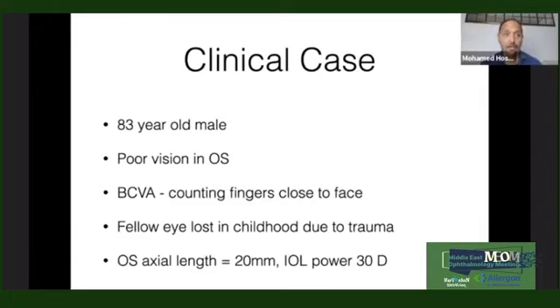If you definitely know that this patient has a weak endothelium, if he had recurrent corneal edema episodes and you had to treat it with hypertonic saline or something, I think definitely I would use an Arshinoff soft shell technique and definitely use Viscoat in these patients as a viscodispersive OVD. But in patients who have surface keratitis from herpes simplex and end up with a surface opacity or a shallow opacity, I don't think I will be overprotective for the corneal endothelium.